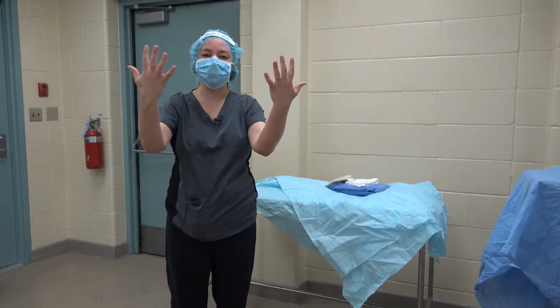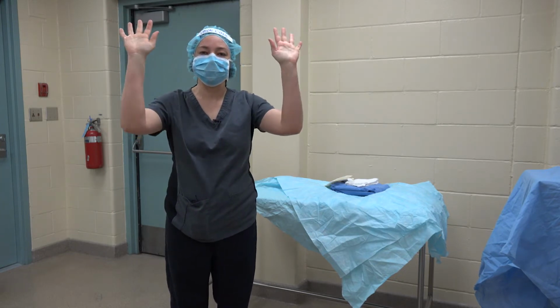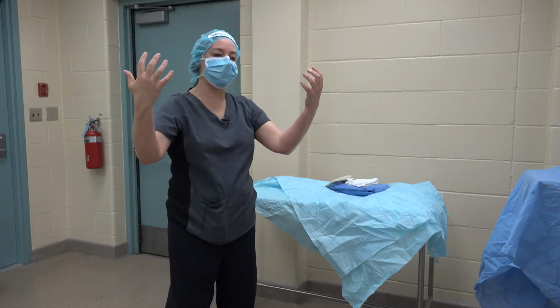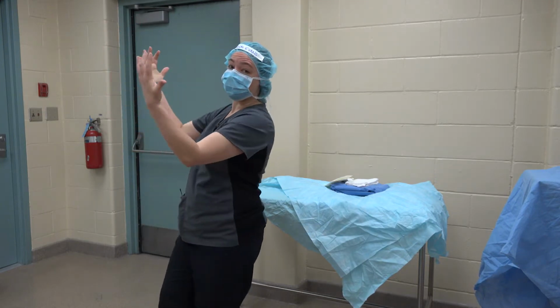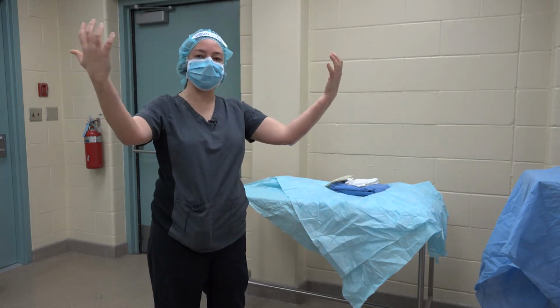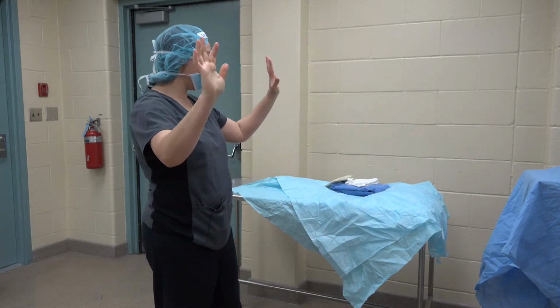So my hands are super wet, and they're still dripping a little bit from my elbows. So again, hands still up, elbows above the waist, hands above your elbows. My hands are also not near my face. You can see that they're not near my face, not near anything else. You need a healthy paranoia for touching stuff now that your hands are aseptically prepped.